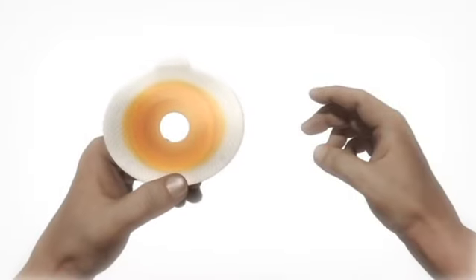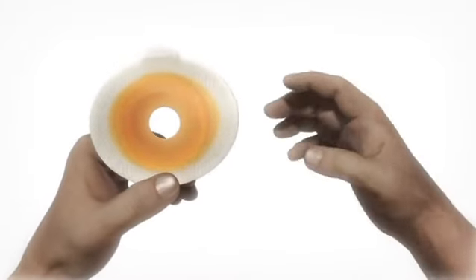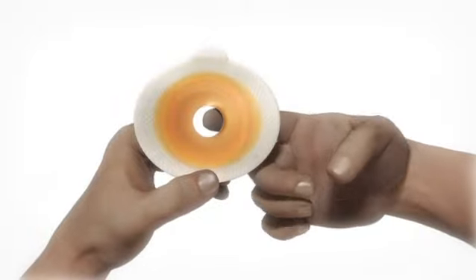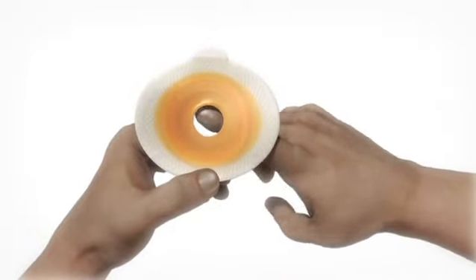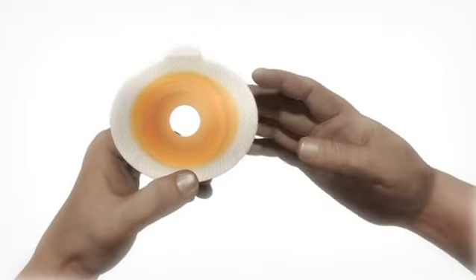After having removed the protecting film, you should even out the edges of the hole by running a finger around the edge. This is to prevent any unevenness of the edge.